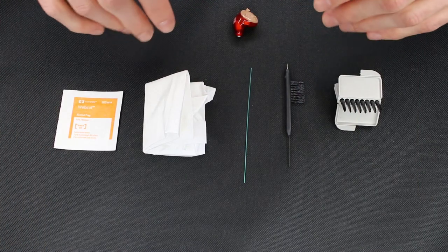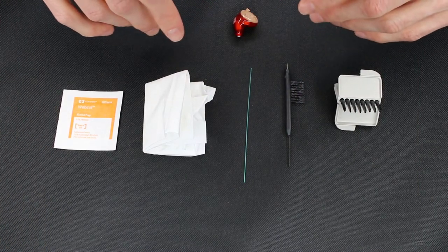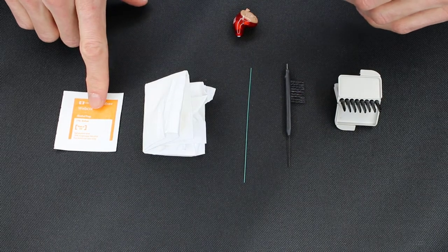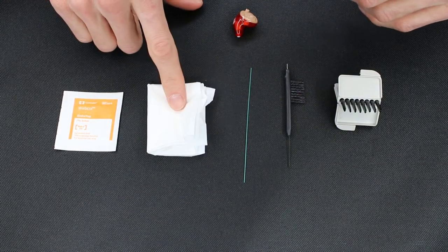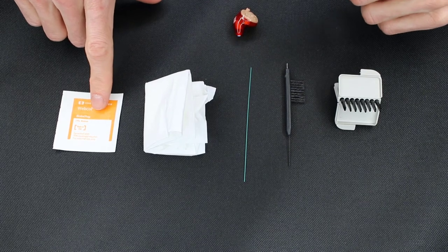When we're getting ready to clean a hearing aid, we need to make sure we have a few things. First is either an alcohol swab or a Kleenex. I prefer alcohol swab, but some people don't like to use them.